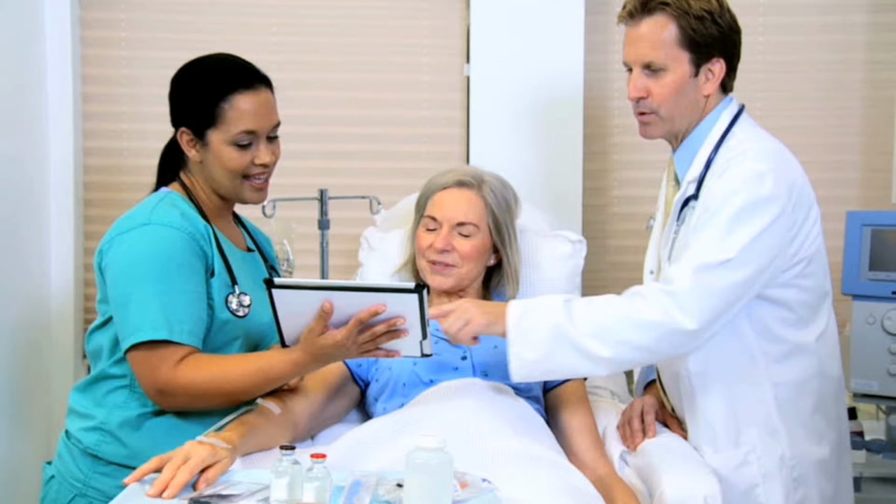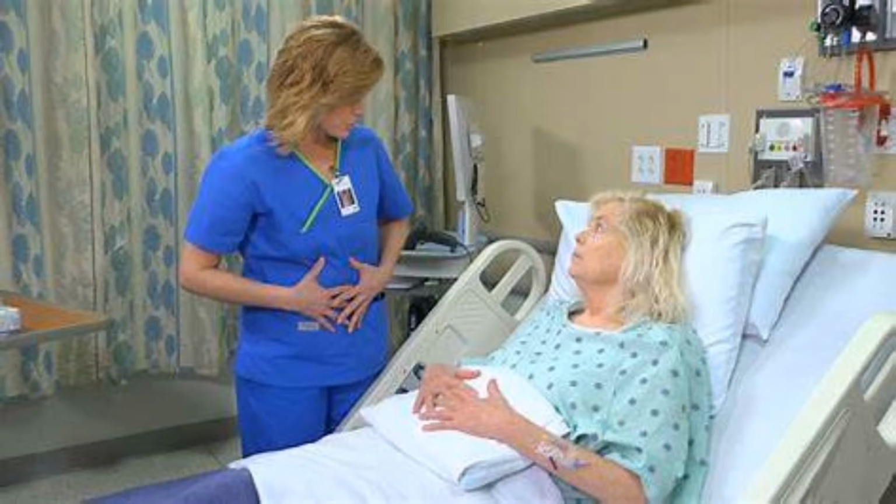Notify the nurse or the physician who will insert the IV. When he or she arrives, bring preparation to the bedside. This facilitates accomplishment of the task. Identify the client and explain the procedure. Explanations allay the client's anxiety.